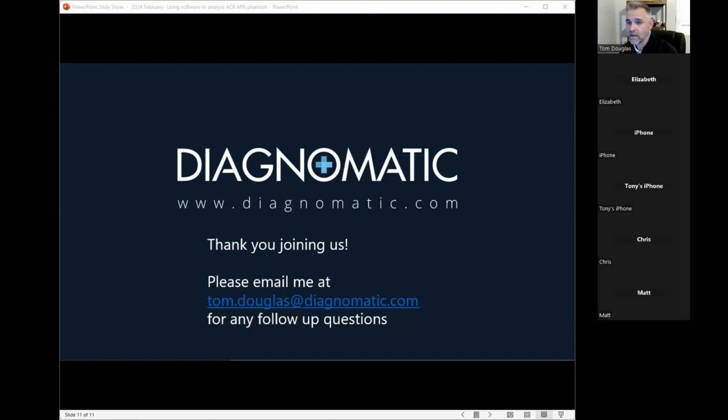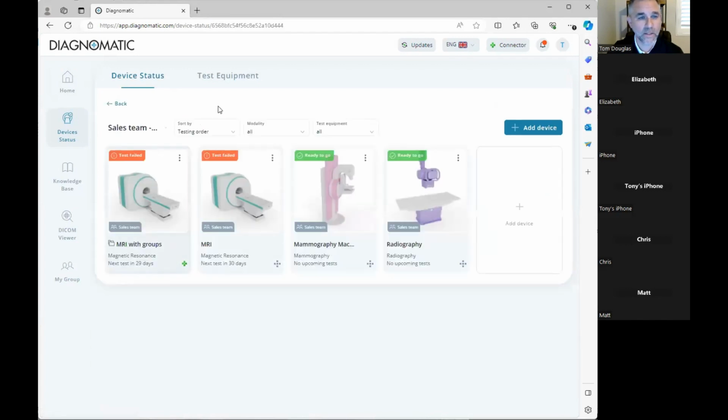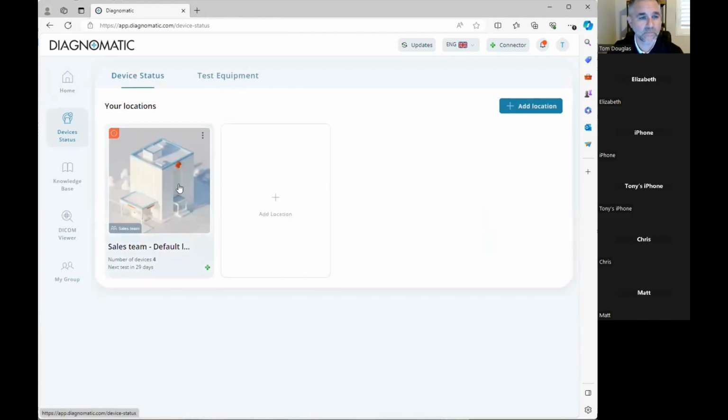We have a question. Chris, if a facility changes their IP address, how do we change the IP address in the software? I guess it probably wouldn't be done in one fell swoop. They'd probably have to make a few changes within the software, but it could be updated.